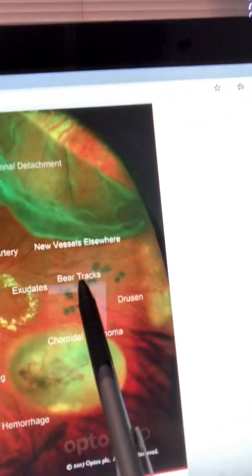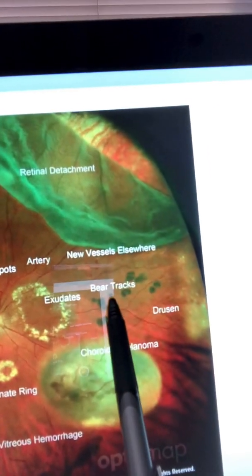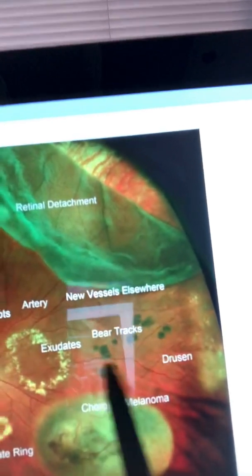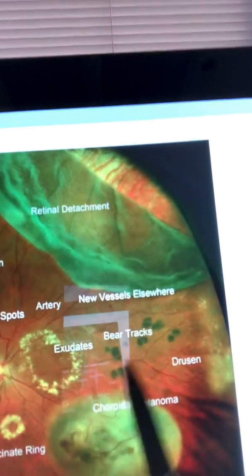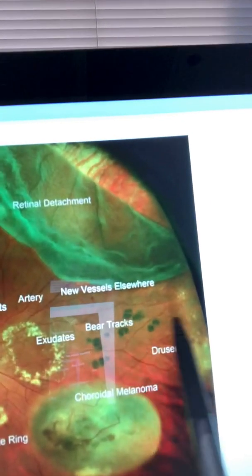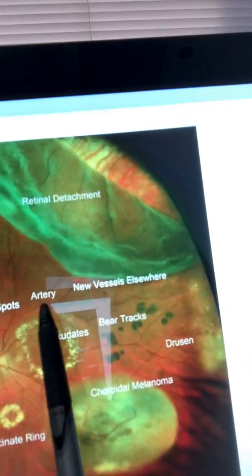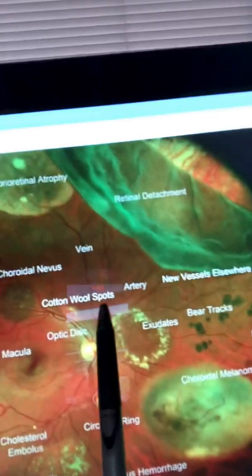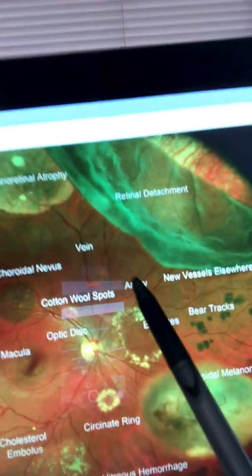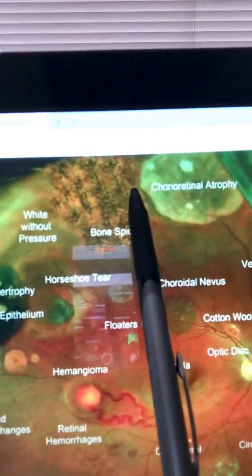Here's another very classic finding — bear tracks, known as congenital hypertrophy of the retinal pigment epithelium, or CHRPE. It literally looks like the tracks of a bear's feet — very dramatic when you're looking at the fundus. I show it to my staff and they get very fascinated. Then you can see the cotton wool spots right there, usually seen in hypertensive retinopathy — here's the artery and here's the vein.